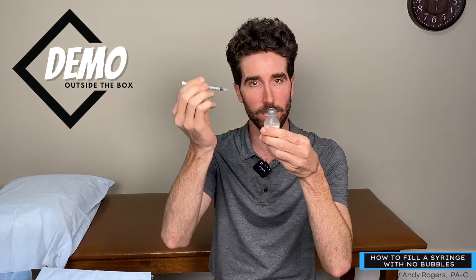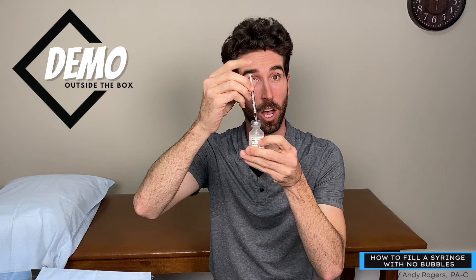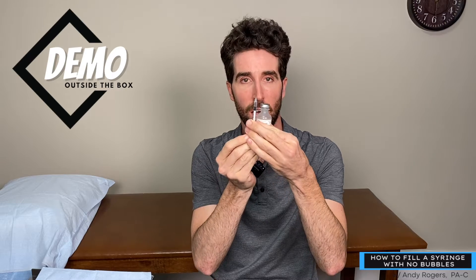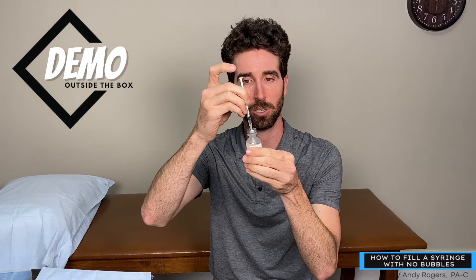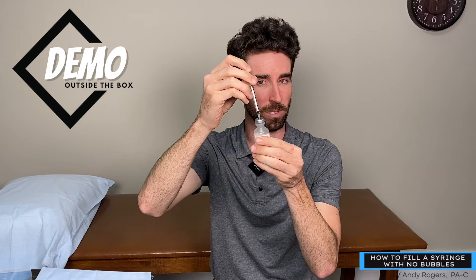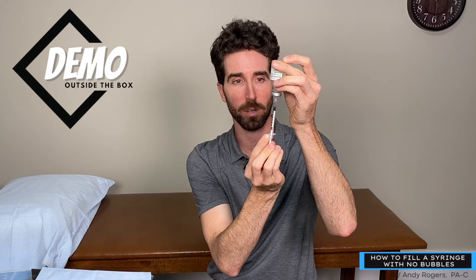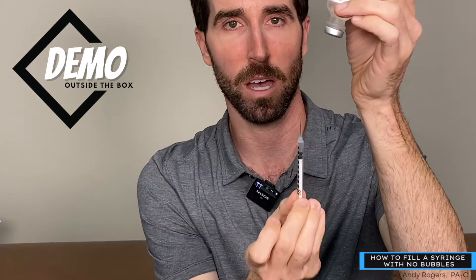The goal is to not get bubbles. So what we're going to do is put the insulin syringe into the stopper — you can see how it's depressed. There's another way to do this: you can draw up, say, 20 units of air, depress it into the solution, and push down — it creates a vacuum. In this case we don't really need it. I'm going to flip while keeping it up and draw up. You'll notice there's air at the top, so I'm drawing up to 20 units.